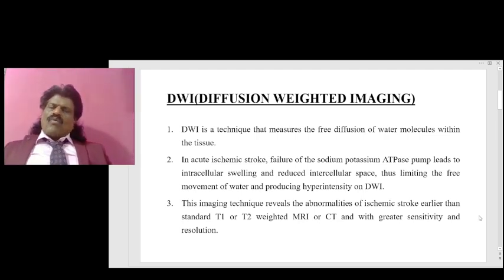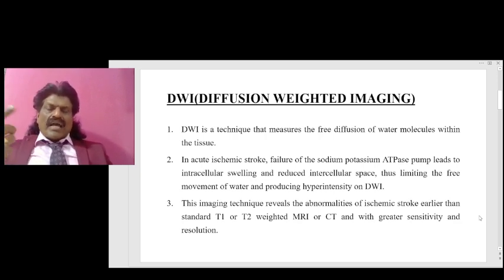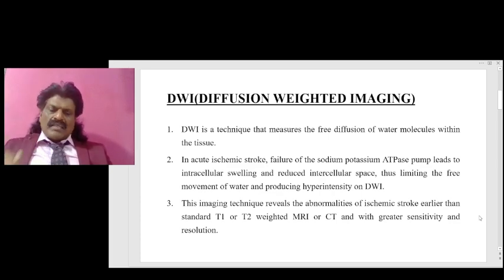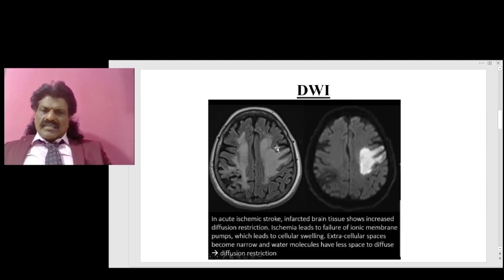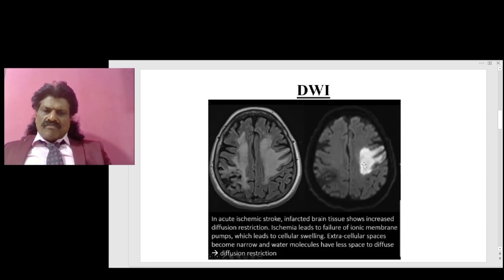This imaging technique reveals abnormalities of ischemic stroke earlier than standard T1 or T2 weighted MRI or CT, and with greater sensitivity and resolution. Therefore we can plan thrombolysis, because we need to get patients within the window period. Here you can see the DWI lesion — it appears hyperintense. In acute ischemic stroke, the infarcted brain shows increased diffusion restriction.